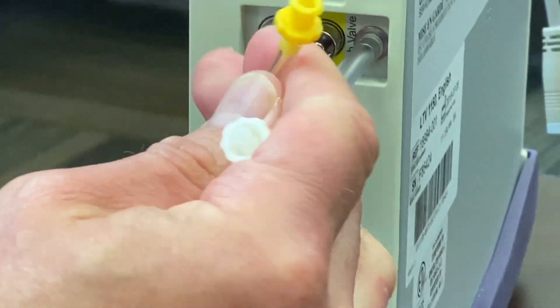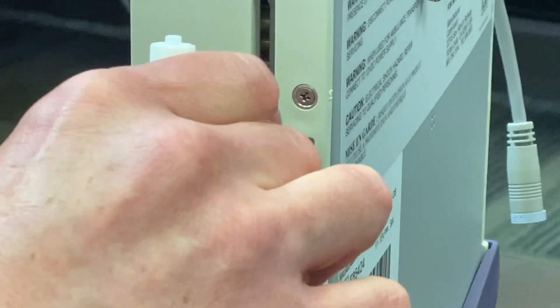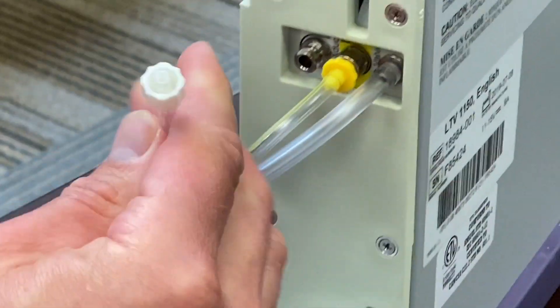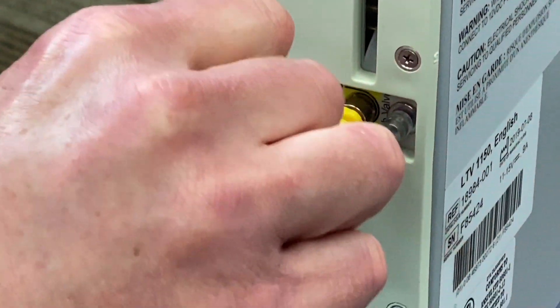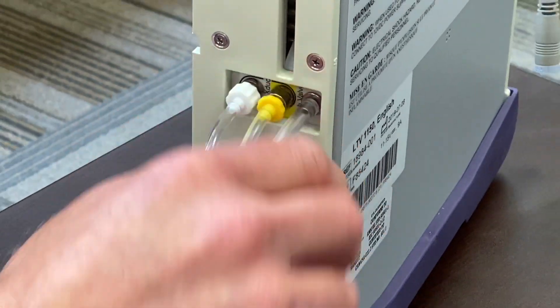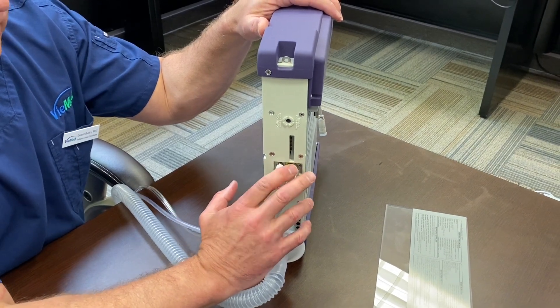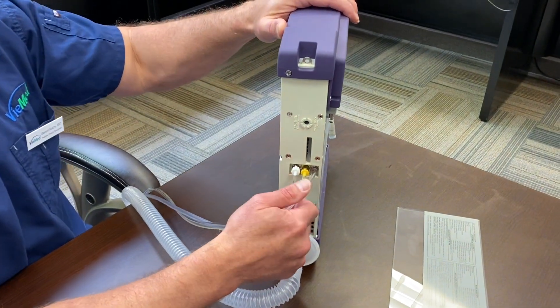For these connections, they screw on, so the suggestion is to counter-twist first, line it up, and it'll kind of set itself. You want to make sure they're secured all the way. If they're not fully secured, it will give you low pressure alarms once you start the vent up.